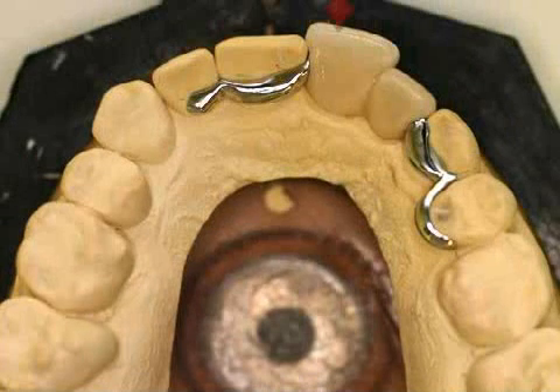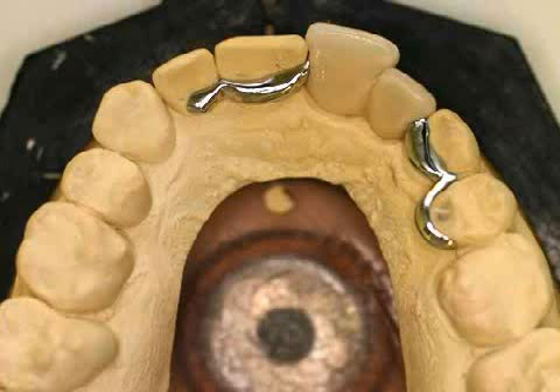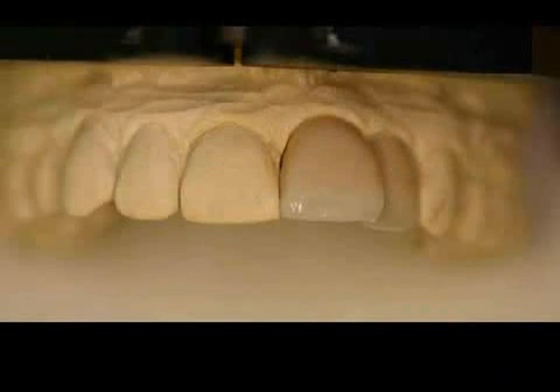The picture shows a metallic Maryland Bridge on a plaster cast. The teeth are ceramic, and the metal grips are placed in such a way as not to disturb chewing and not be visible from the outside.